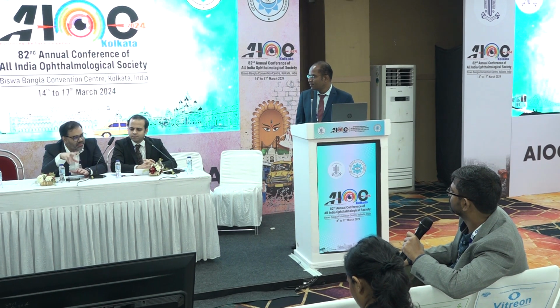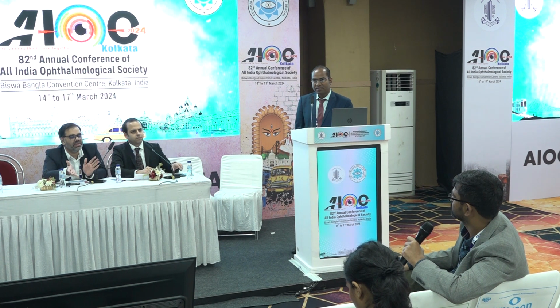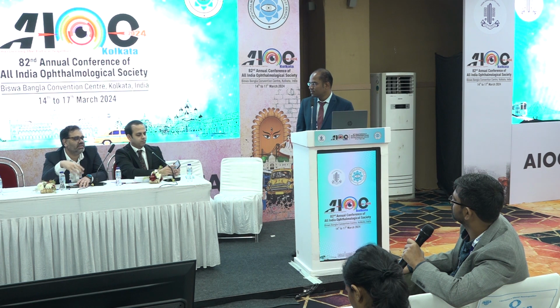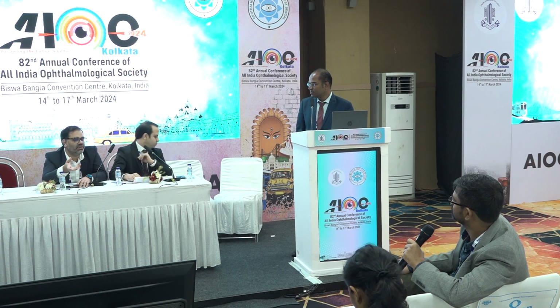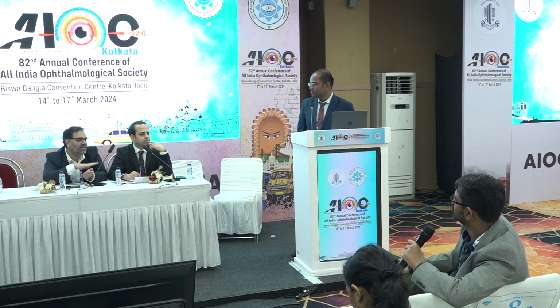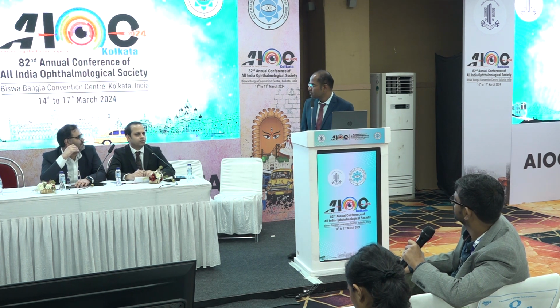Yes, that was one thing he showed, that he levitated it. If you make the tunnel first and then try to go in, the anterior and posterior chambers are one compartment, so the lens tends to whirl around inside the intraocular space, and that becomes an issue. So you need not open the tunnel at the first go. First go in, try to levitate, and then possibly proceed. But if you have a good, well-sealed tunnel, it shouldn't be an issue, right?